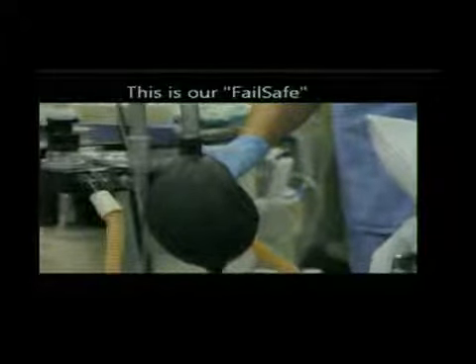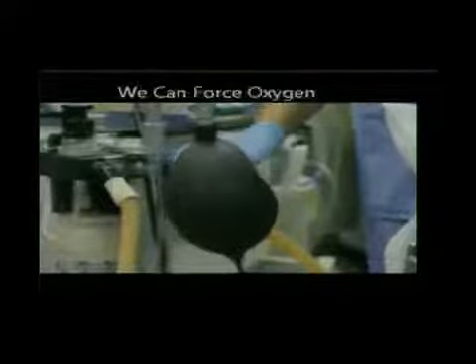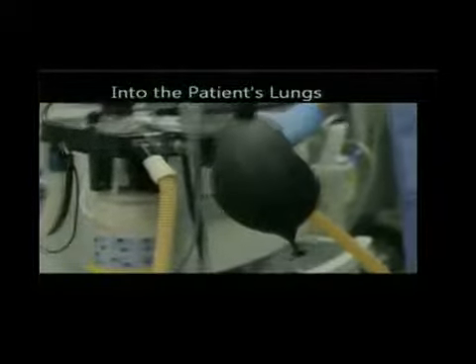Stop. This is our fail-safe. The patient's not breathing. You open the airway. No air is still moving. This is our fail-safe to put air into the lungs of the patient. If they won't do it, we will do it for the patient. Please continue. So we can force the oxygen into the patient's lungs if the patient is not breathing.